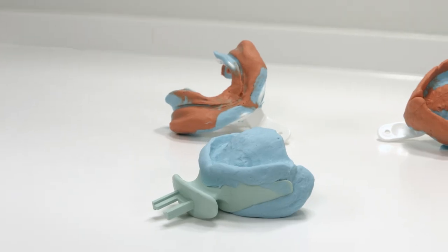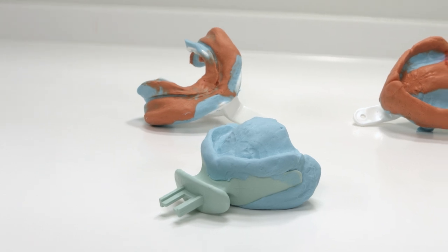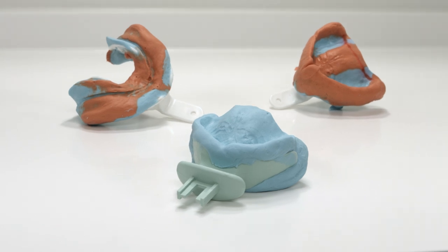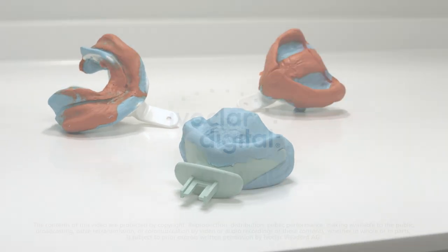The two initial impressions, the preliminary bite record, and the values defined for the occlusal plane are sent to the dental laboratory for the design of the 3D bite plates.